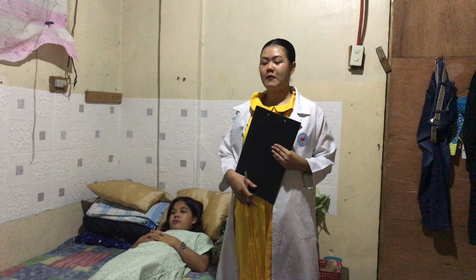Okay, so also we will be checking the expiration date and the intactness of the pregnancy test package. We'll just check if it is accurate or not. It says here the expiration date of our pregnancy test kit is November 29, 2023. It is also complete because we can feel the dropper and the indicator area of the pregnancy kit itself.